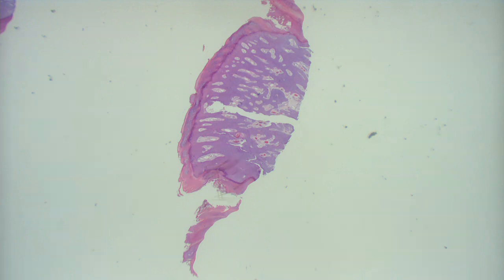Okay, so here we have a shape of a kind of polypoid neoplasm. Yeah, it might even be sessile. Kind of like it looks like it's sticking up, though. You're exactly right. See massive, kind of a lot of hyperkeratosis. It's possibly like an acral or volar surface. Good, very good. Volar skin.